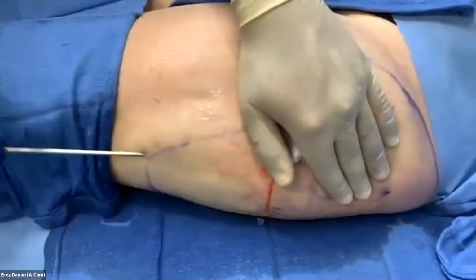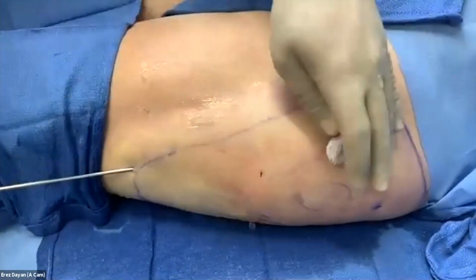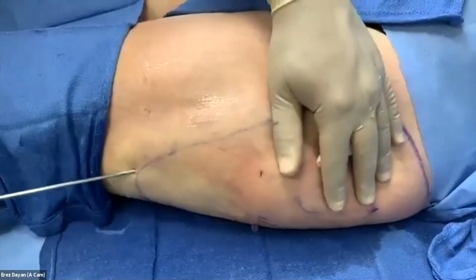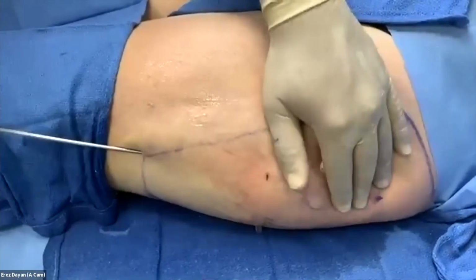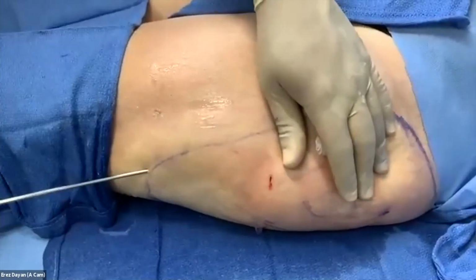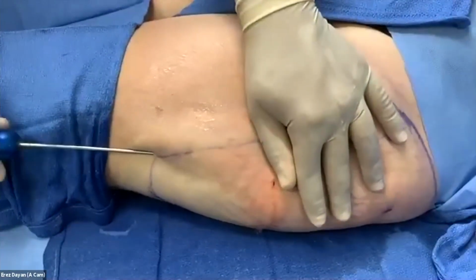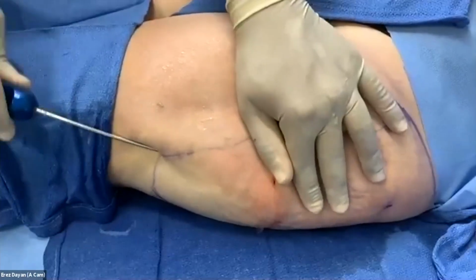It is a little bit liquefied, or I don't know about to say liquefied. It's not like an ultrasound lipo where it's liquefied, but I wouldn't fat graft this fat, personally. Although people do fat graft Vaser fat all the time, so I think it's probably fine. I have a bunch of cannulas, but I like a 3 millimeter for me is good. It's just kind of a medium range.